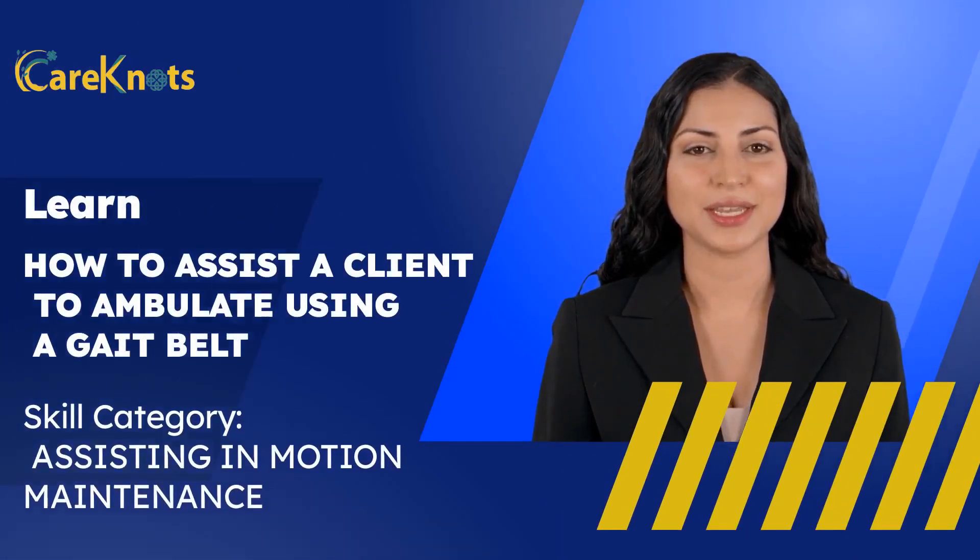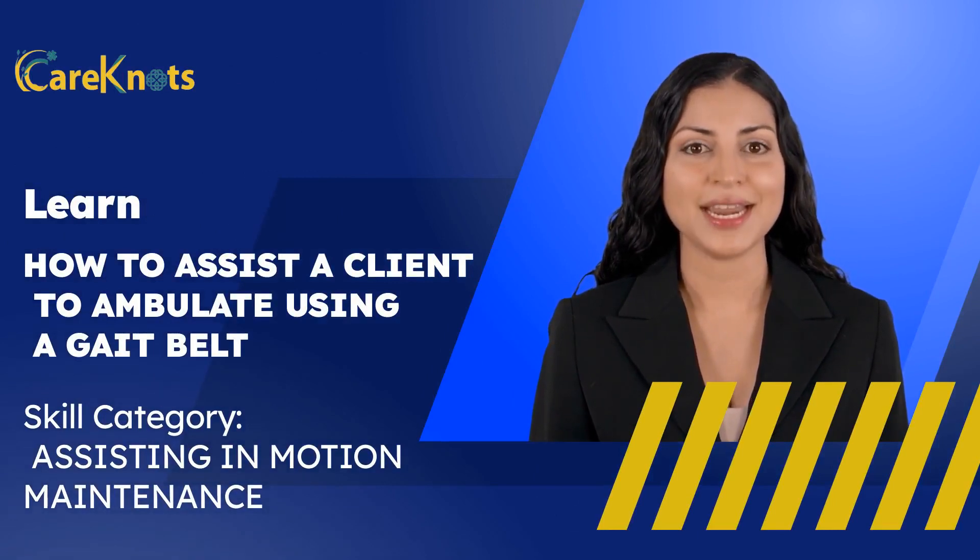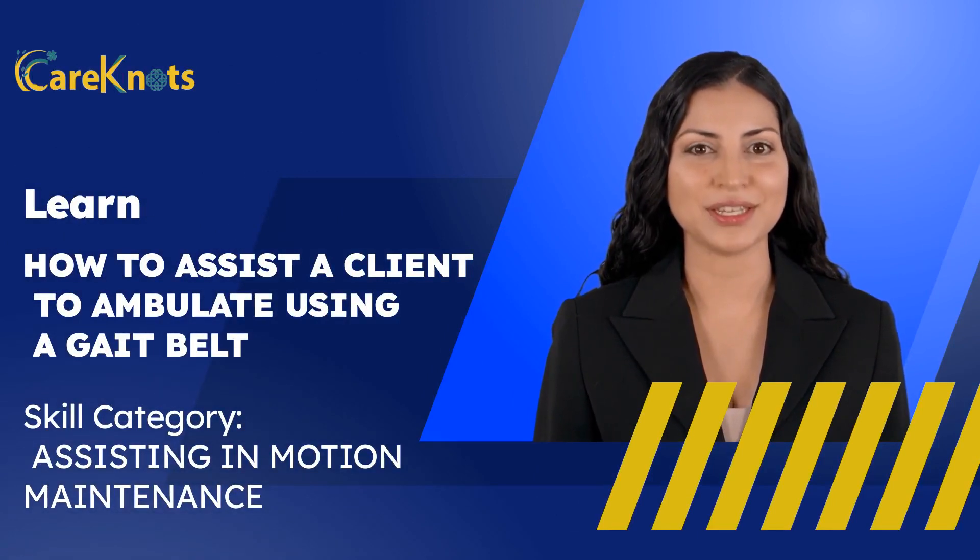Hello there, and welcome to Care Not's training program for caregivers. The skill that we are going to show you today is how to assist a client to ambulate using a gait belt. So let's have a look.